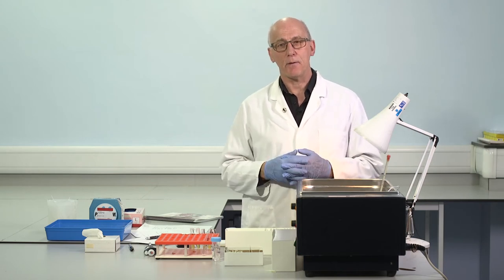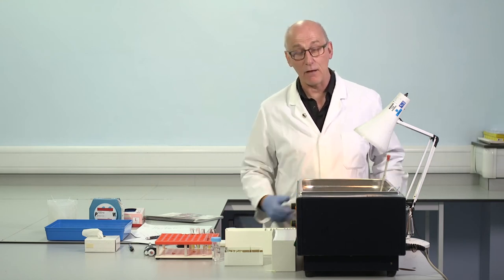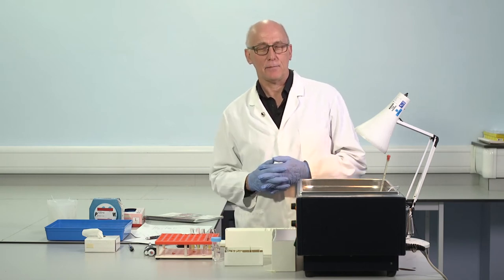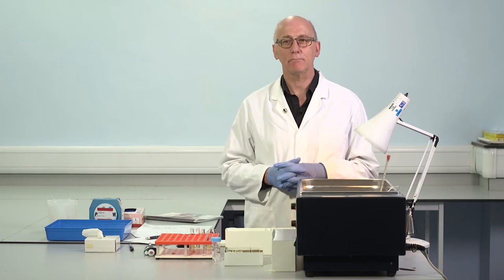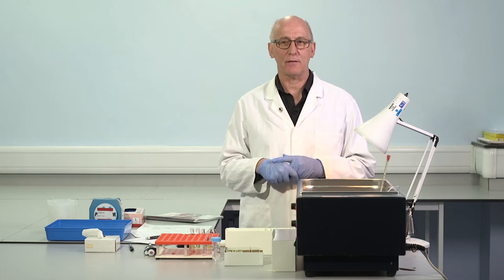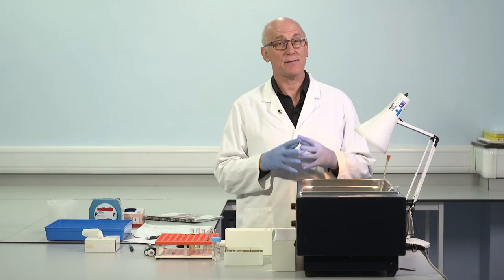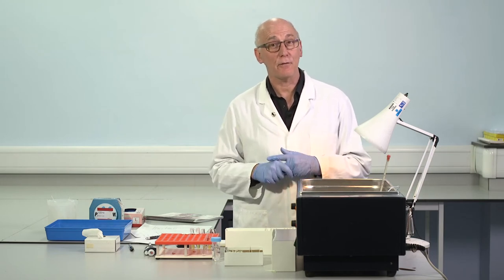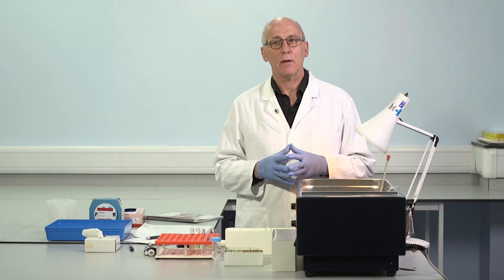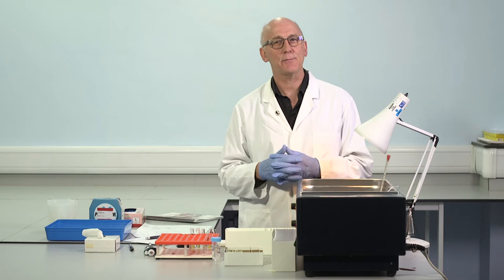The second important thing to keep in mind is that it's possible to inadvertently identify an outlying result that could be a relevant abnormality. It occurs from time to time in relation to clotting. We know that, for instance, in many populations, the incidence of factor V Leiden is about 5% of the healthy normal population. So if we're testing 20, 30 subjects, it's not a surprise that we'll find one or two of these in that group, and that's what happens. There may be other unexpected defects which are abnormalities detected as part of this process. So we need a mechanism to deal with that.